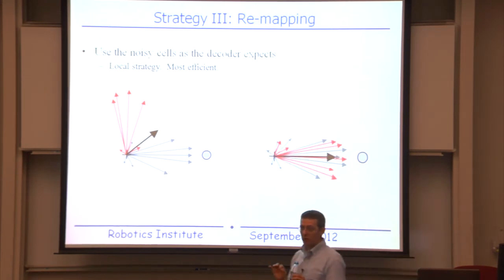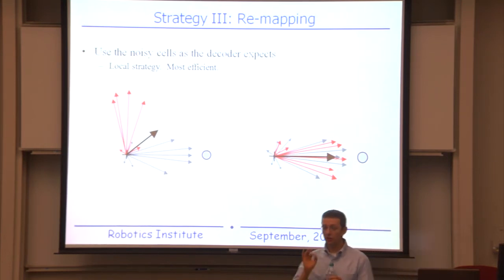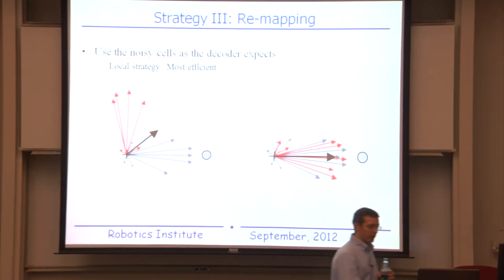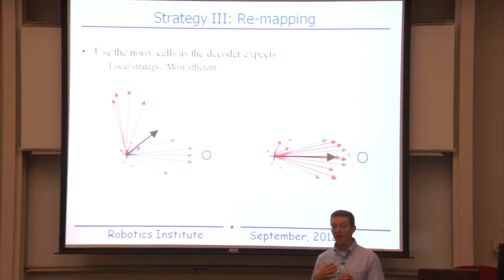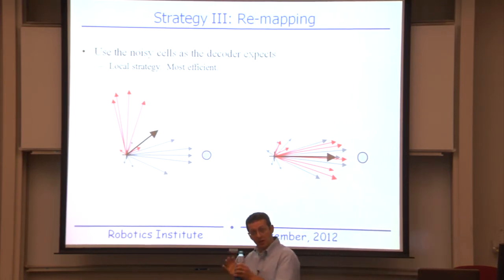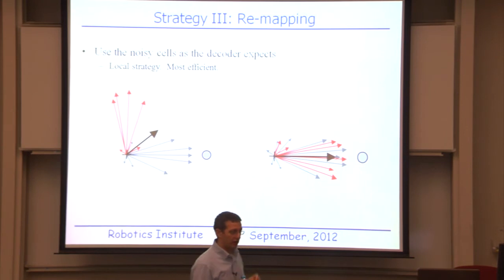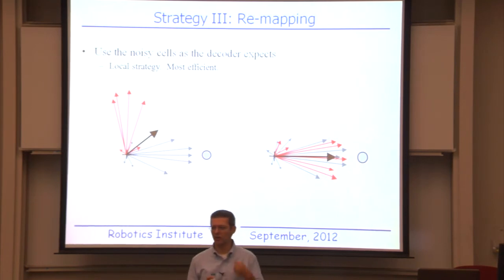The third strategy he could use is something we call remapping. All right? And so the idea behind remapping is that if these neurons are forcing the cursor to move north, what he could do is learn to just use those neurons when he wants the cursor to move north. Or, said another way, if he's trying to make a movement towards this target, he needs to recruit the population of cells that have preferred directions that point towards that target and that we have not perturbed. And he has to recruit the population of cells that have preferred directions that point south and that we have perturbed. And he can combine those two groups, and that results in the most efficient movement towards the target. So this remapping is again a local strategy. He has to identify the cells that we perturbed, and then he has to learn how the algorithm is assigning them to cursor direction. He has to start using them according to how that algorithm defines them.